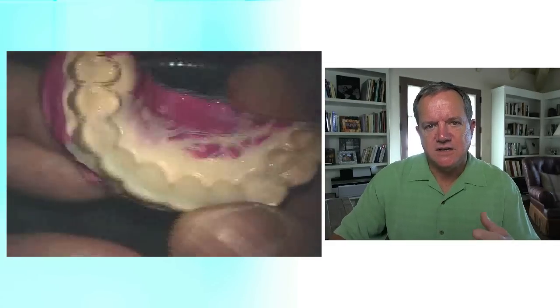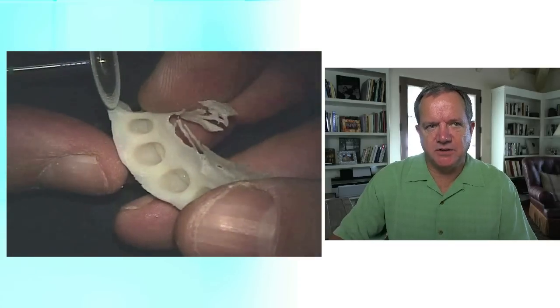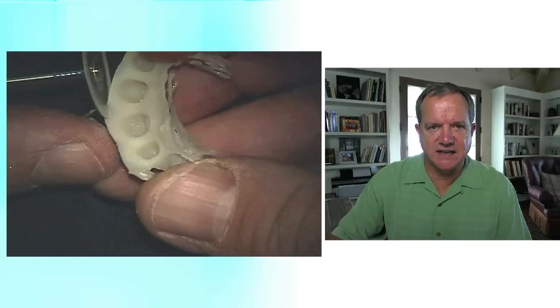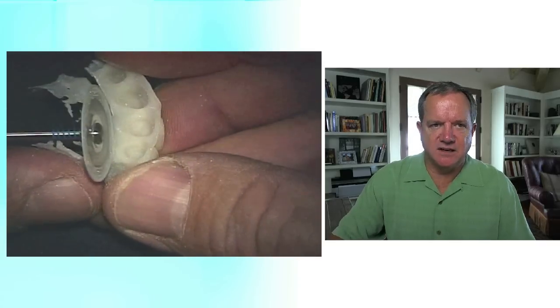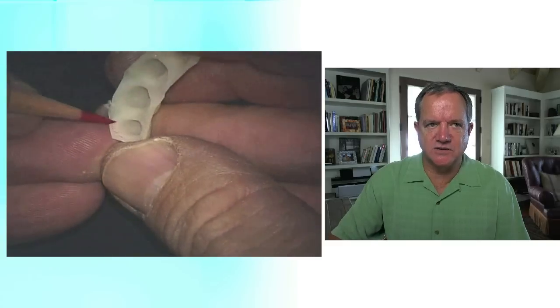We've now got the temporary. We've removed the copyplast from it — it goes in the alcohol. Five or ten seconds is plenty. Typically I'll use a disc to get the gross amount off because it's fairly gentle. This is a 911H — it's a double-sided diamond disc. So I'm just taking off any excess flashing that's real obvious. The burrs tend to chatter more than the disc does, so that's why I use the disc first.